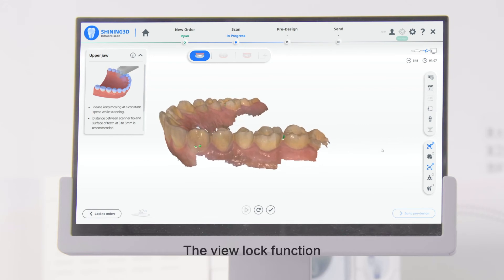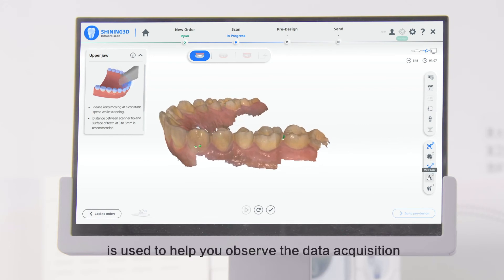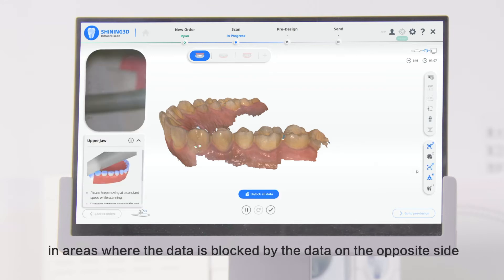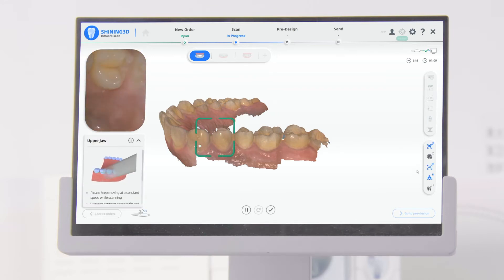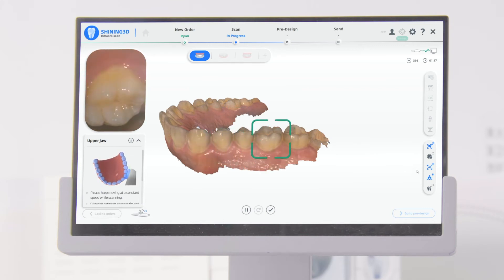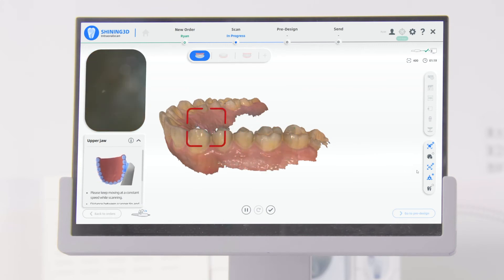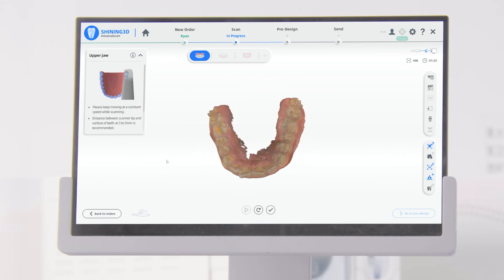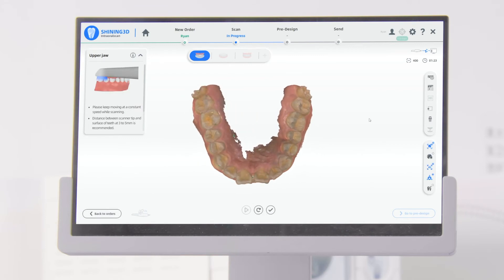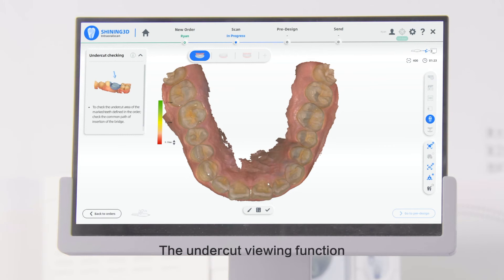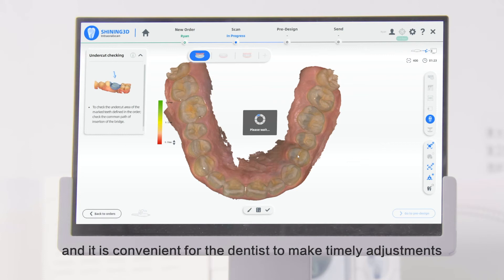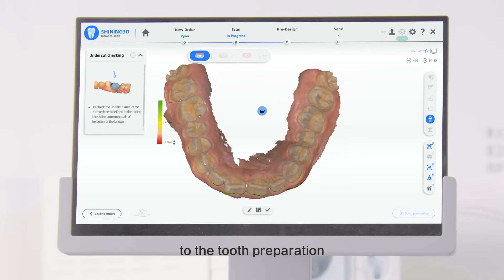The View Lock function is used to help you observe the data acquisition in areas where the data is blocked by the data on the opposite side. The Undercut Viewing function can be used to view the undercuts in real time, and it is convenient for the dentist to make timely adjustments to the tooth preparation.